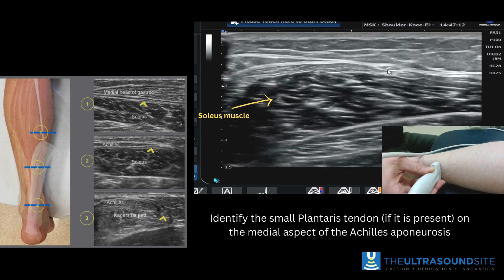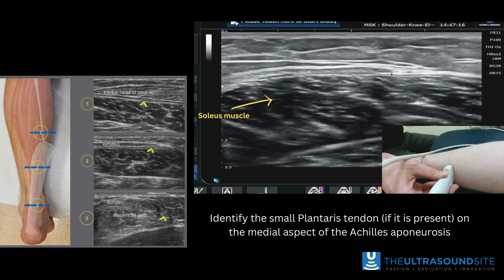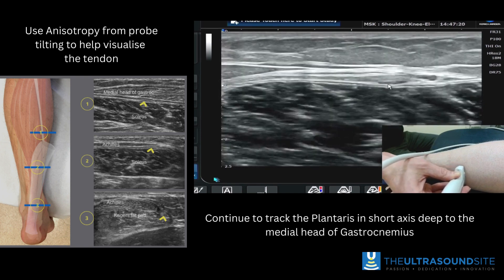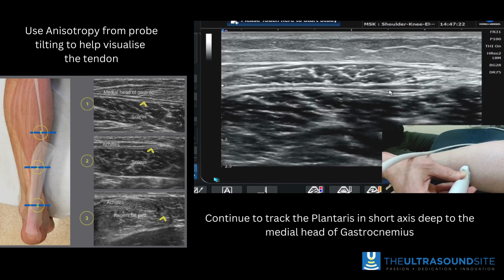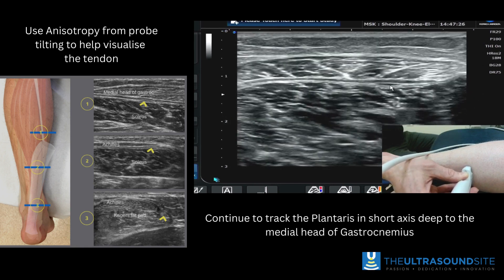It sits very superficially at this point. As we become more proximal, you'll see it dives down and goes essentially laterally to sit superficial to the soleus muscle and deep to the medial head of gastroc, which is starting to appear.